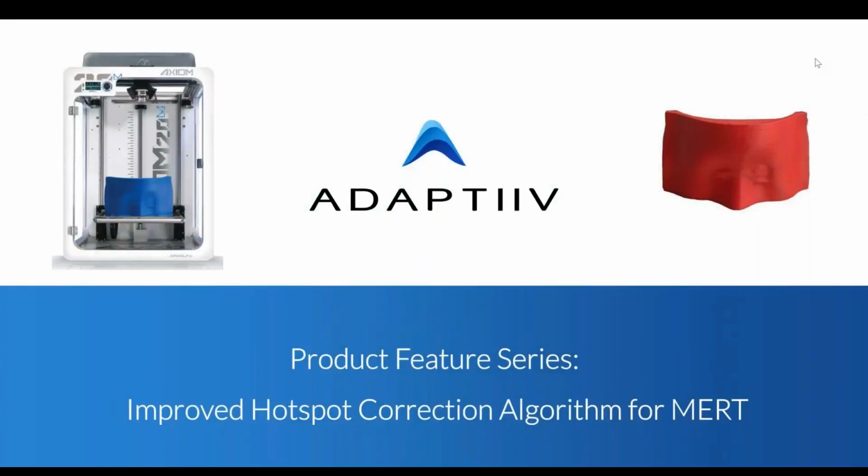I'm Rohit Seth, the Director of Marketing here at Adaptiiv Medical Technologies, and we are pleased to be offering a product feature series webinar today on improved hotspots in our 3D Bolus software for modulated electron radiation therapy.